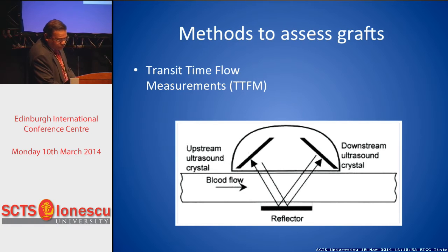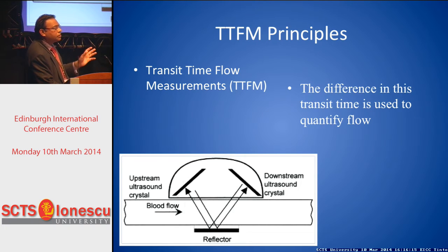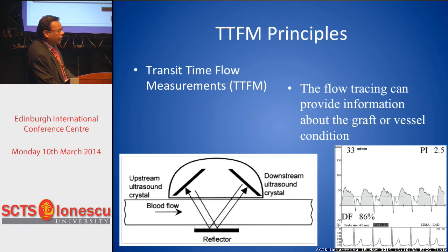Now coming to TTFM, which is the focus of my talk, this transit time flow measurement technique relies on ultrasound for the non-invasive assessment of graft flow during coronary artery bypass graft surgery. It is based on the principle that ultrasound traveling against blood flow will take longer to reach the transducer than ultrasound moving along with the blood flow. The difference in the transit time is used to quantify flow. It correlates linearly with the blood flow. And a trace that you get from this TTFM measurement gives you information about the graft or vessel condition.